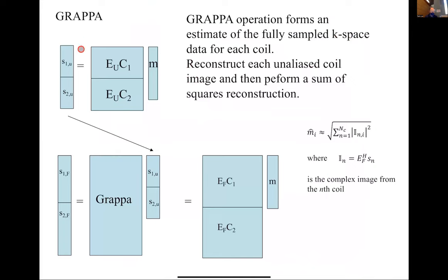So basically GRAPPA is saying, this is what I have. I've got these coils, right? They're undersampled. But instead of solving, this is the SENSE equation, right? SENSE is saying, let's just brute force solve this head on, and it comes up with a very nice solution. GRAPPA's like, well, maybe what we could do is take this undersampled data and just make my measurements more. So I'm going to fill in the data where I didn't have the data. So now I can use the full coefficients. And this is my overdetermined equation I had before, where the solution to this was just sum of squares.